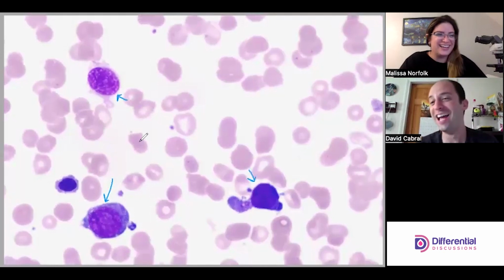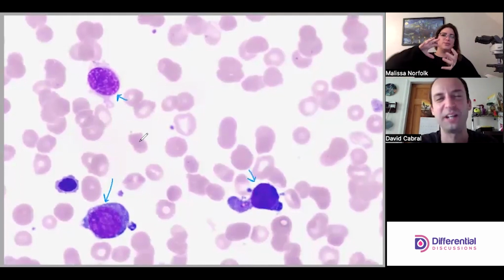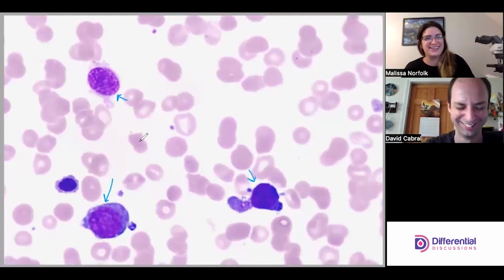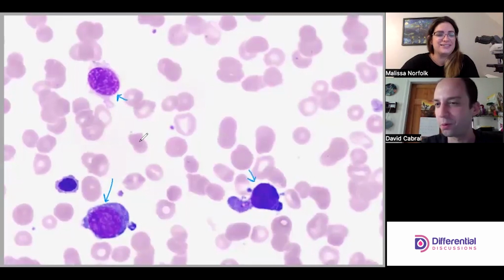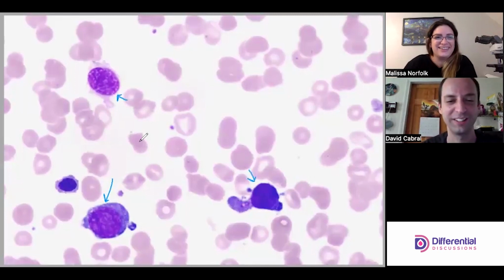In a fully mature megakaryocyte. And in my defense, regular techs aren't usually looking at megakaryocytes very often. And even when you are, think of it again, it's a 3D cell. So when you smash it into a 2D structure, it's hard to count the number of lobes inside of a megakaryocyte. It's more like obscure theory. I can be both good on theory and then poor with it, depending on my utilization. And it's coag, so I've had someone helping me with coag for a while now. Cool. So this one, he stole 2 of those nuclei.